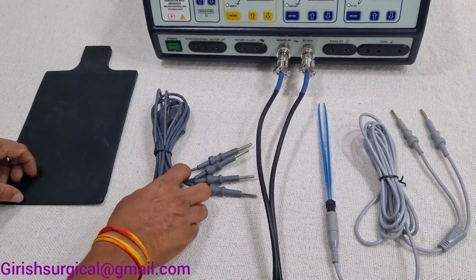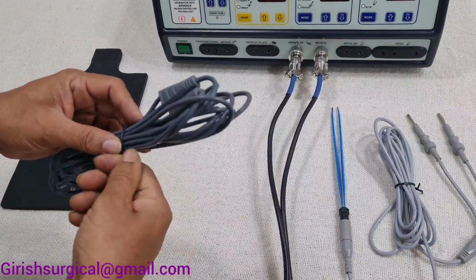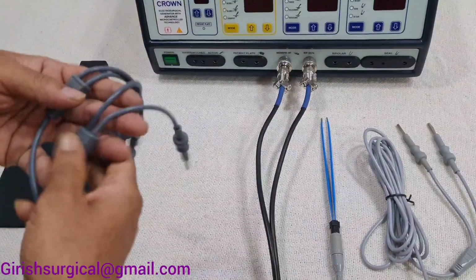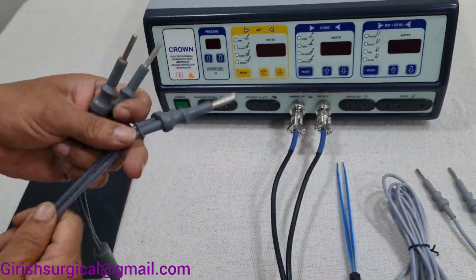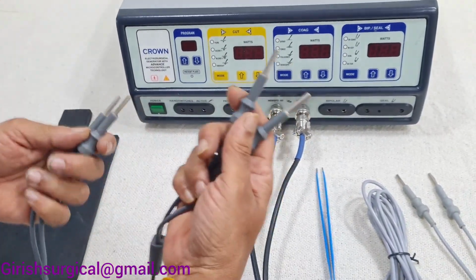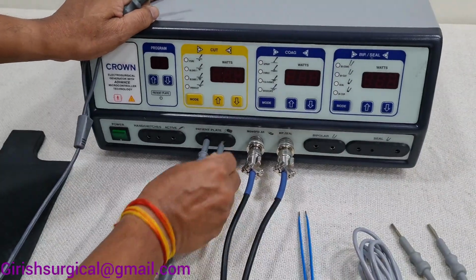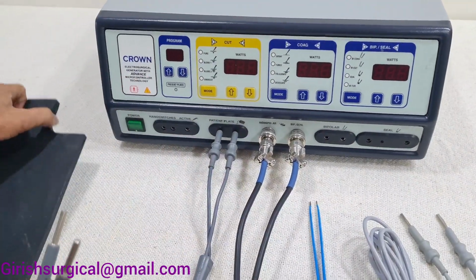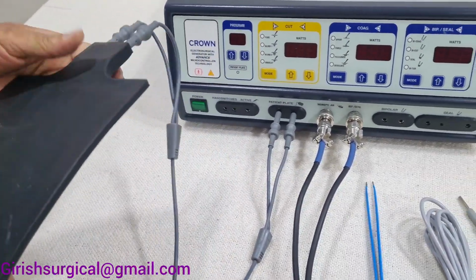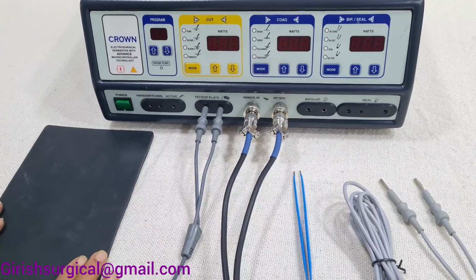Now we'll connect the patient plate. There are a total of 4 jack pins in this cable, and all the accessories are silicone reusable ones. Any two, you can put this or this, any pair will do. Connect these two pins to the patient plate port and this to the silicone or the metal patient plate which is provided with the machine. That basically we provide silicone only.